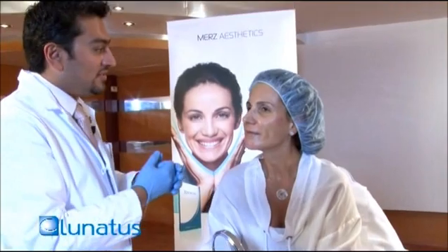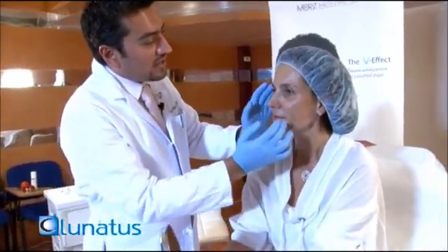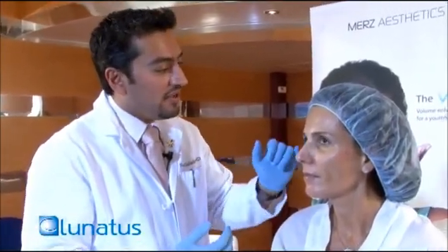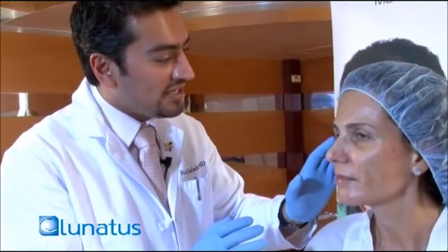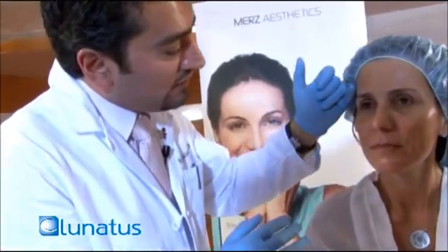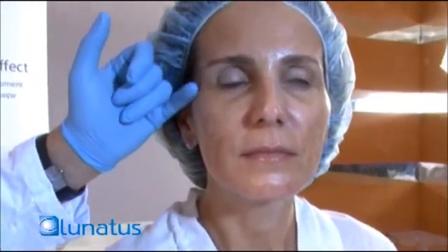Now, one of the areas you can inject calcium hydroxylapatite is the temporal areas, and if you can see Roberta here, the temples, okay, are a little bit sunken. Okay, this is very, very normal. It's basically one of the signs of aging. So you want to give a little bit of volume in the side over here, and you inject a very, very small amount of Radiesse. That's put very, very deep, right where the muscles are. Okay, and by putting it in this area, you fill it up so that you have this curvature going from here towards the zygomatic arch. So that will get rid of the hollowness over here, and give her a fuller, much younger look.